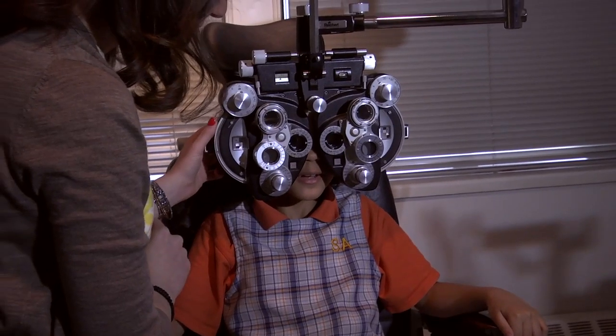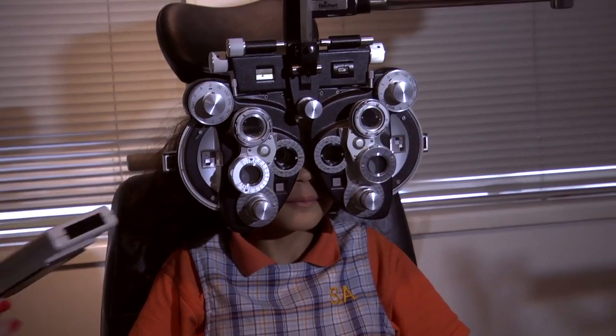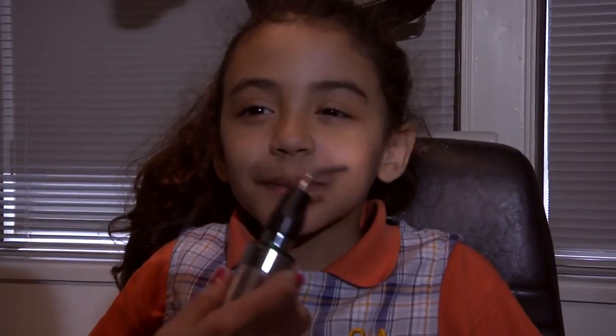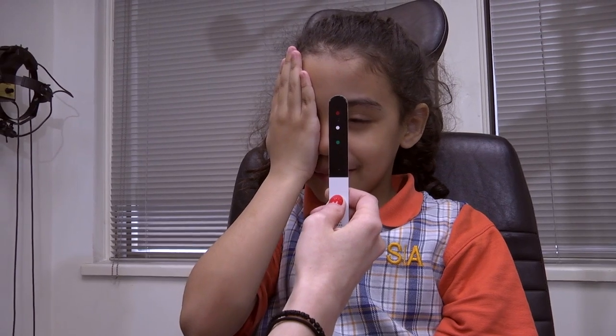In older children, it is similar to adults where we can put them behind the phoropter and ask them which is better, 1 or 2. Based on a few different tests, we can have a good understanding of the child's glasses prescription if necessary.